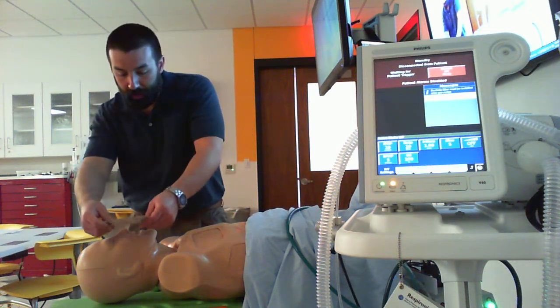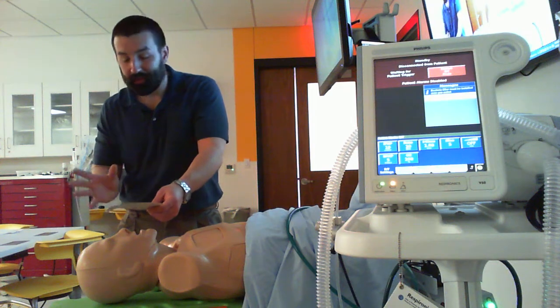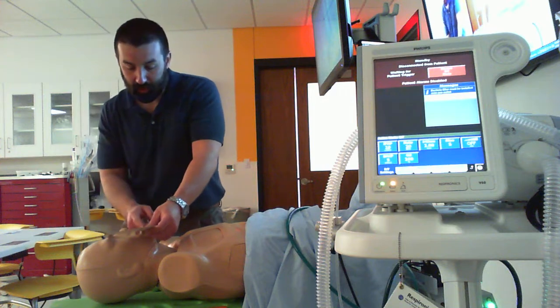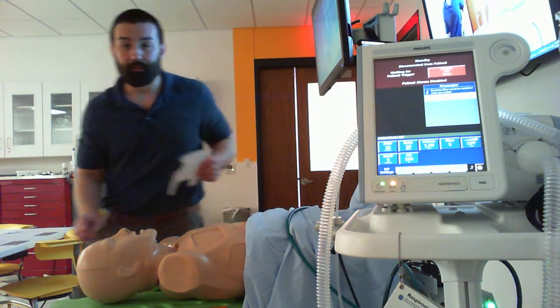So a lot of times we're holding something up, and with time you do get pretty proficient with whatever your masks are. He'd probably already be on an oxygen device or something, so I'd be moving that out of the way just a smidge. All right, this guy's size is large, so I'm looking at that cleft of the chin up to the top of the bridge of the nose.